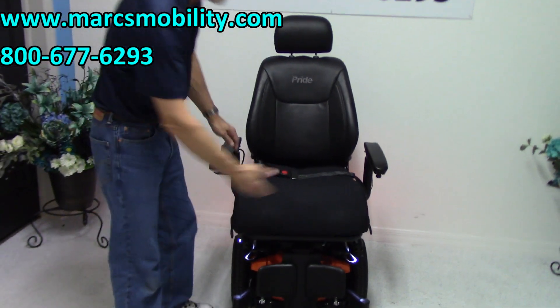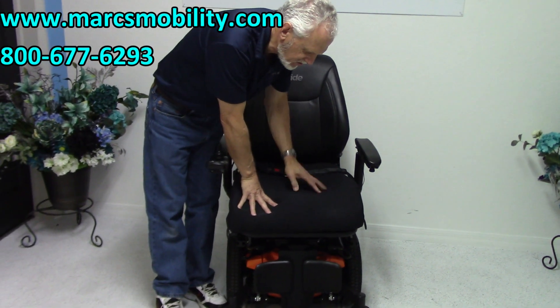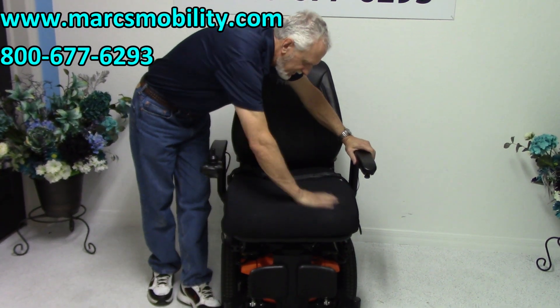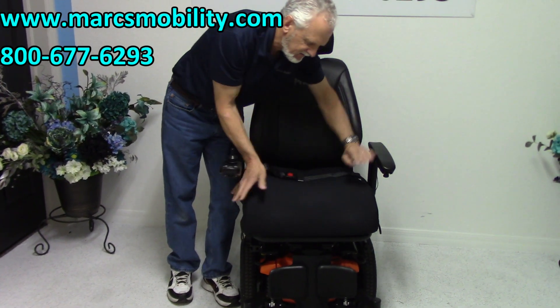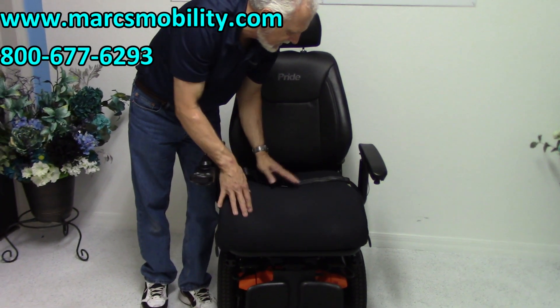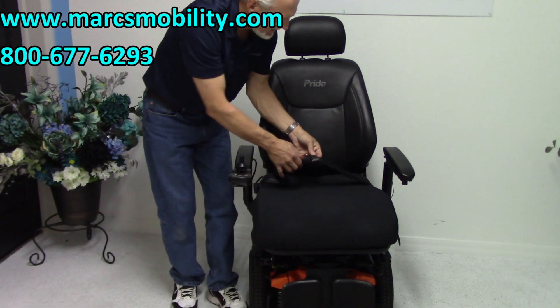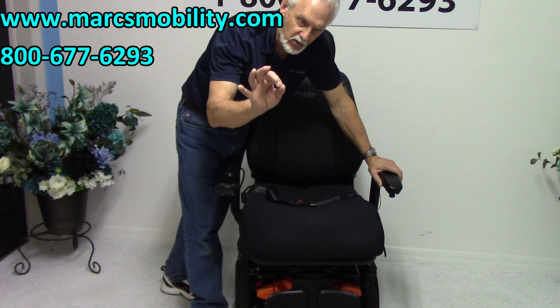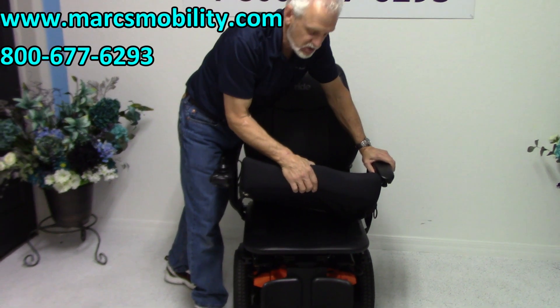The seat on this chair is a super cushiony cushion — it's contoured on the outside. It's 21 inches wide by 21 inches deep, with a depression in the back where you sit for comfort. It does have a safety belt. This is a replaceable cushion — if you have a better cushion or you want a different cushion, it comes right off and you can put your own cushion on here.